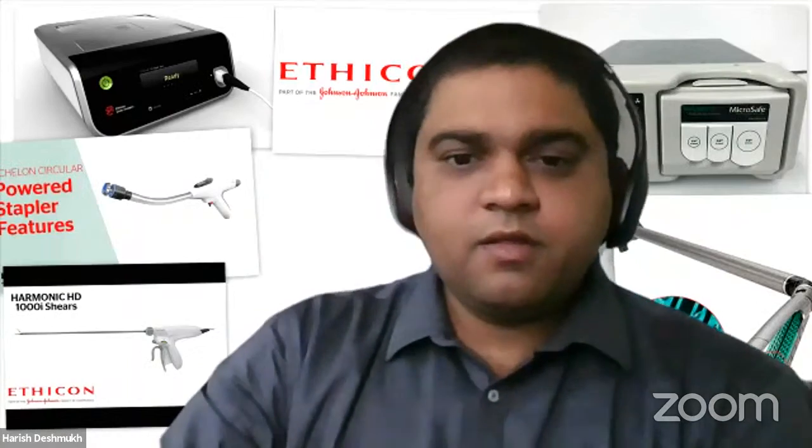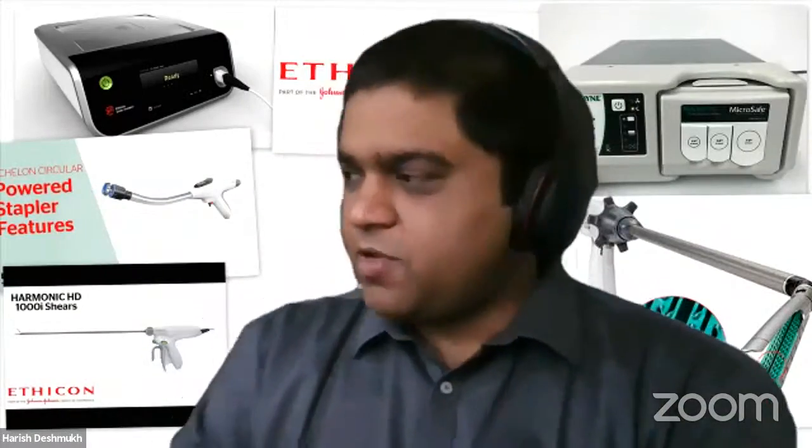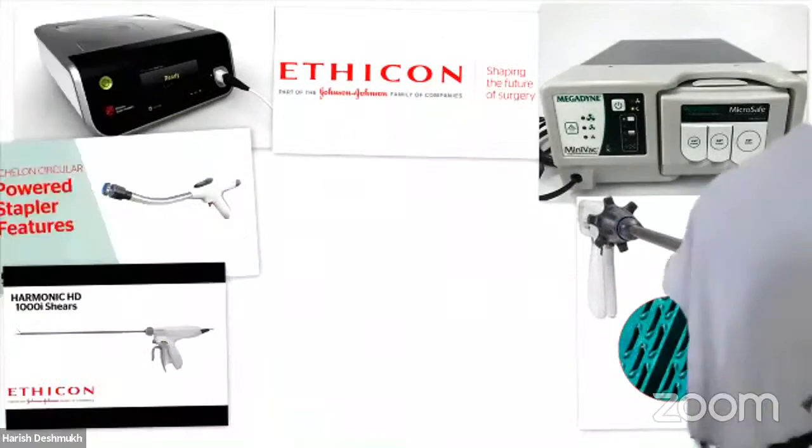Harish, do you have a mannequin there so that you can load these as in a bowel, so that it will come till the end of your cartridge, so that there should not be space left behind and the cartridge goes waste? Why? Because the tissue should be properly placed in between the two blades. Am I right? Yes, sir. Just give me a couple of seconds, sir.